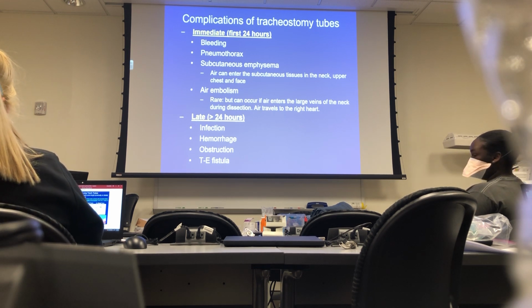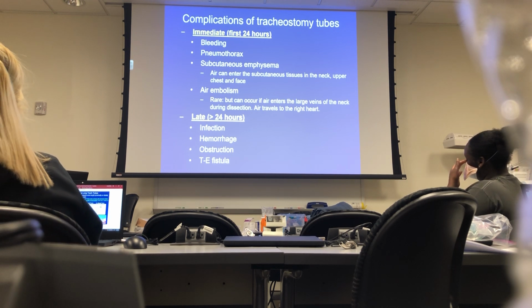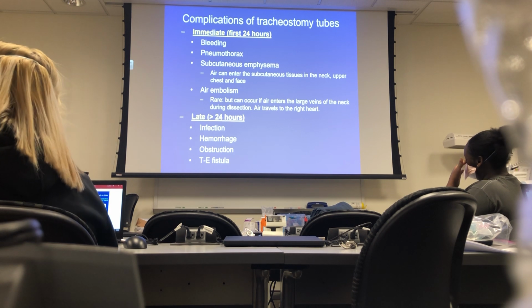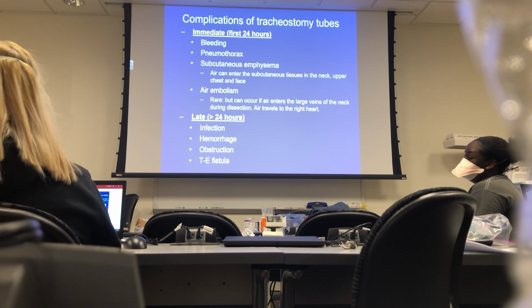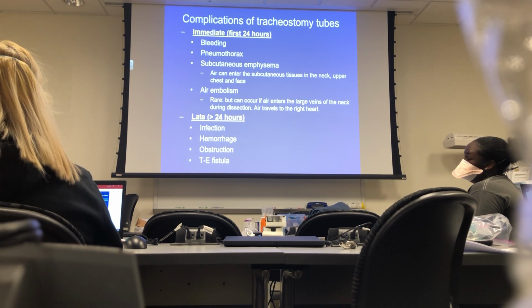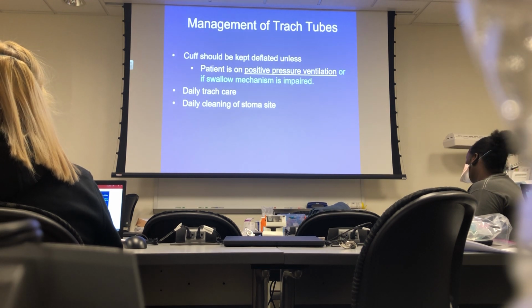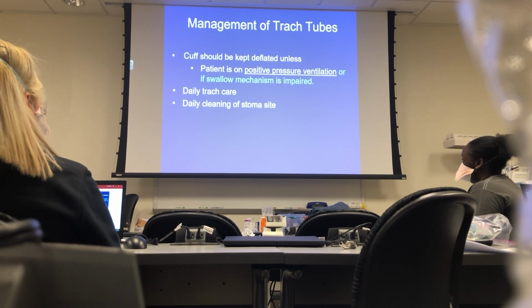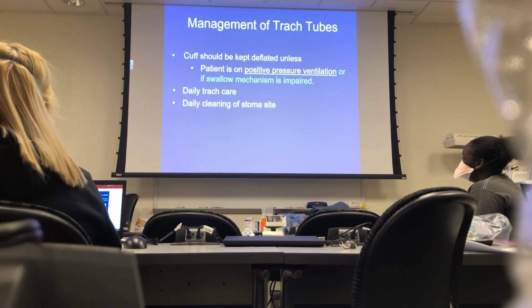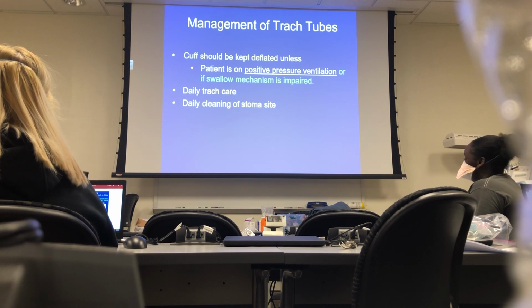Late stages, meaning after 24 hours, of course it's a cut, you can get an infection at the site, you can have an excessive amount of bleeding, the trach can obstruct. That balloon, if the pressures are high on that for days and days, can cause a hole between the trachea and the esophagus. You get a fistula, okay? The management, cuffs should be deflated unless the patient's on positive pressure ventilation, all right? But if they can't swallow, then it's going to have to be up because they're going to aspirate their saliva.